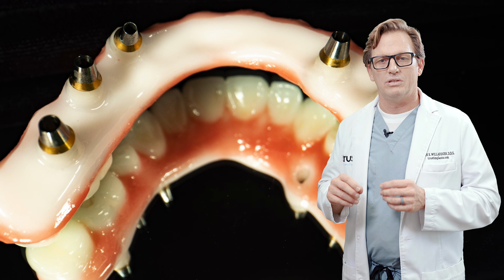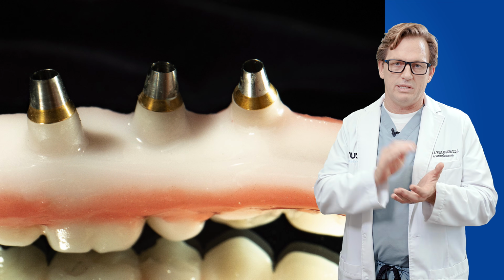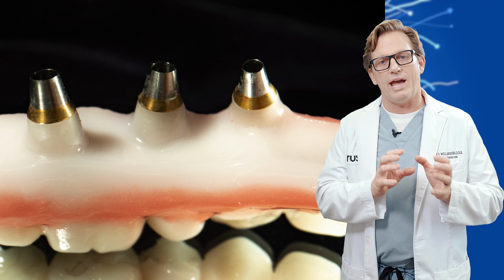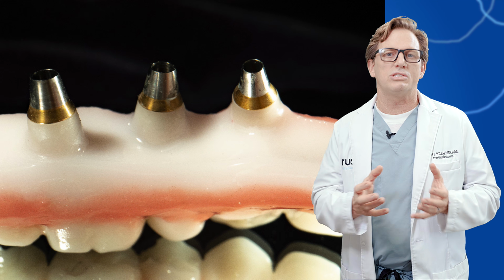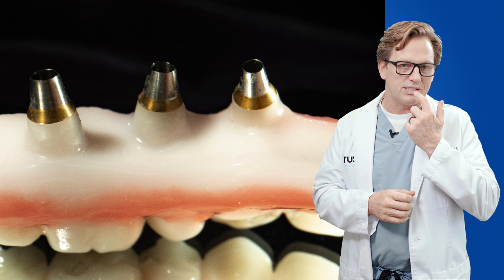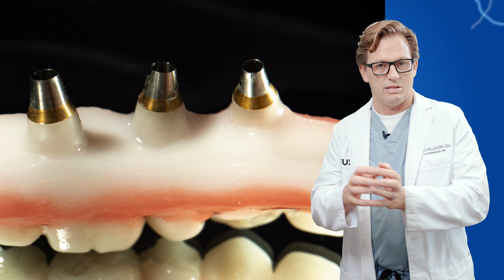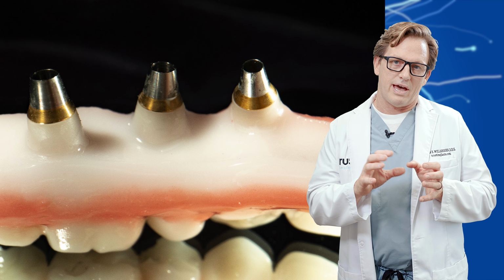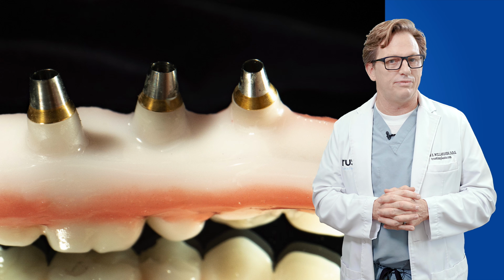So if we were to magnify where the gum tissue and the implant and the prosthesis all meet together, that area has to be very precise. And the materials in that area, it's the most important part, because that is where problems can arise. It's not necessarily at the edge of the front tooth. It's down deep where the implant and the prosthesis and the tissue all meet. And so that's where the materials used in a case are very important.